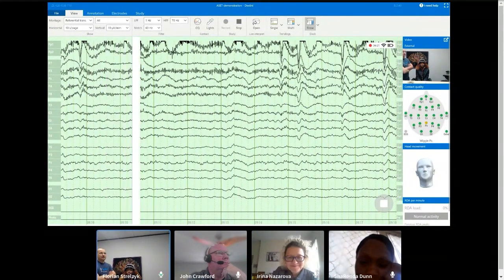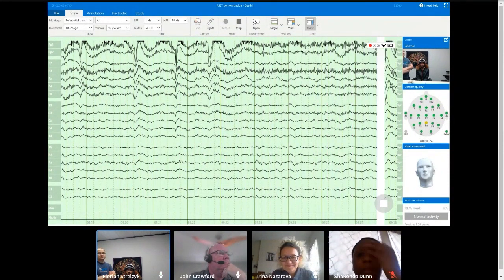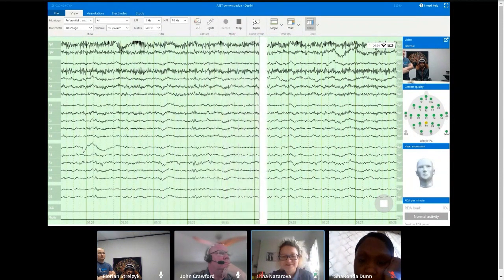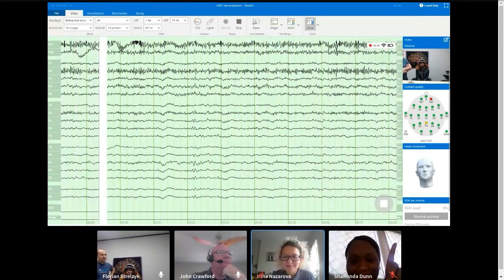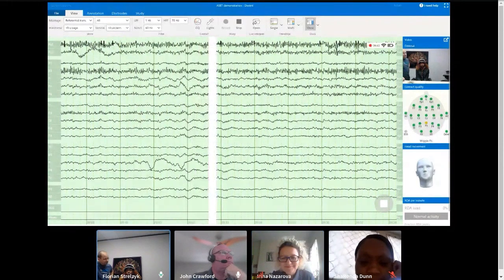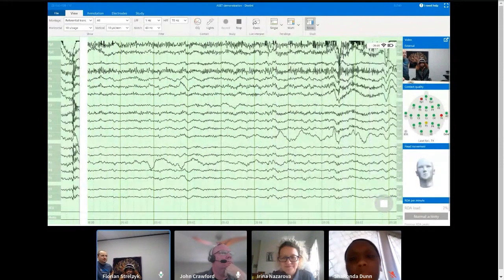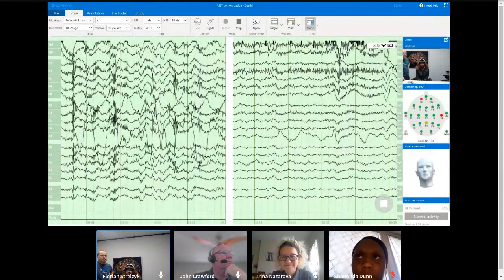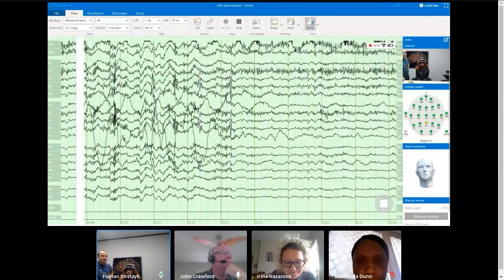And now close your eyes. Relax. That's good. Any questions? If you have any questions, please ask or ask us in the chat. Now, can you give us some jaw clenches, like you're chewing gum? Yeah, so you see muscle activity. Perfect, thank you. Good. Any questions?